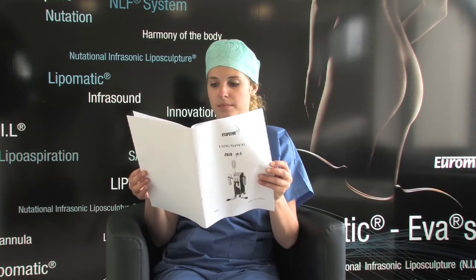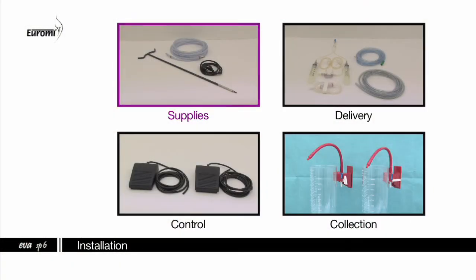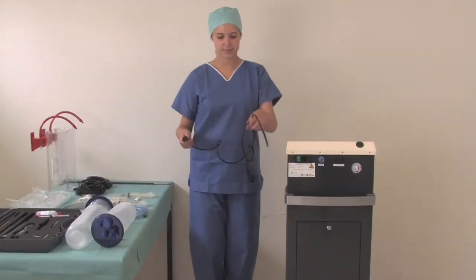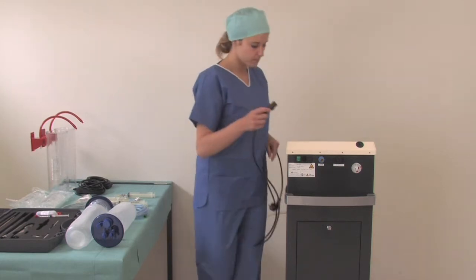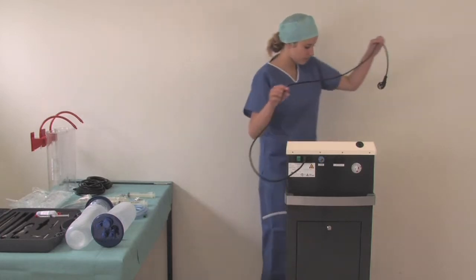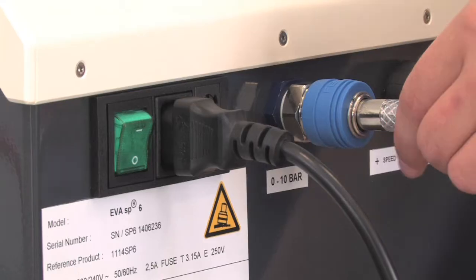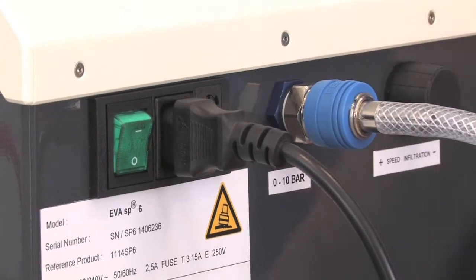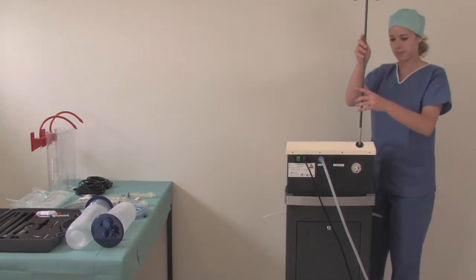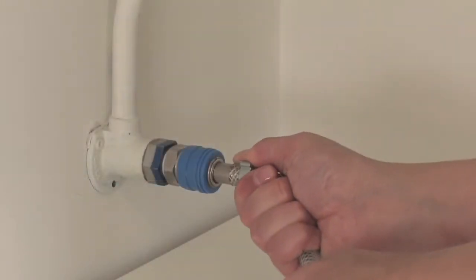Please read carefully the user manual before using the machine. Supply accessories assembling. First, connect the cable to power supply. Systems are designed to operate on all kinds of power supplies. Connect the air source cable to the machine. Screw the infusion stand. Connect the other end of the air cable to a medical air source.